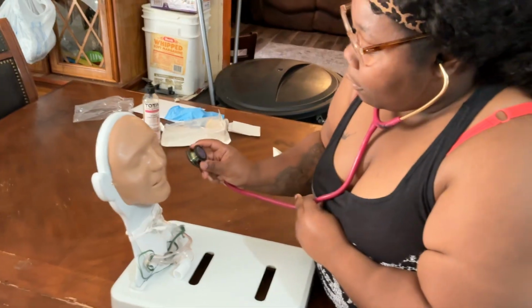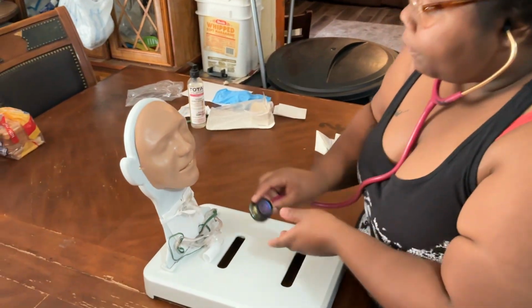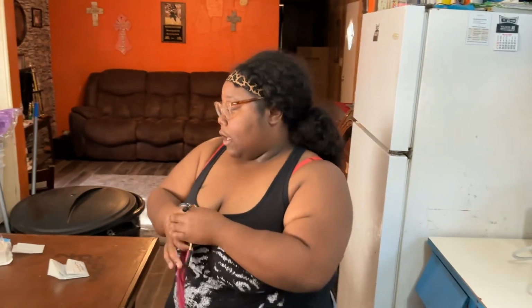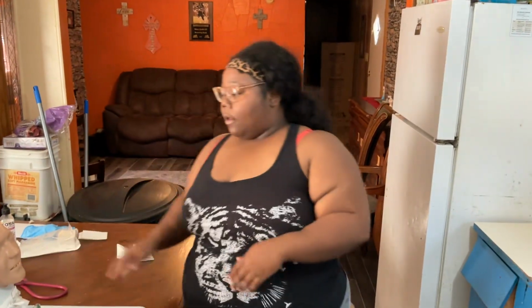I'm so sorry. Before I would have started that procedure, I would have put an O2 sat monitor on my patient, hooked it to my Dynamap to monitor my patient's O2 sat during that procedure. Let me verbalize that. I would have put that O2 sat on my patient to monitor my patient's oxygen level before starting the procedure. So oxygen level is still good at this moment. I cleaned it again. Right upper lobe, right lower lobe, right middle lobe, left upper lobe, left lower lobe. Lung sounds better and clear at the moment, which is great.